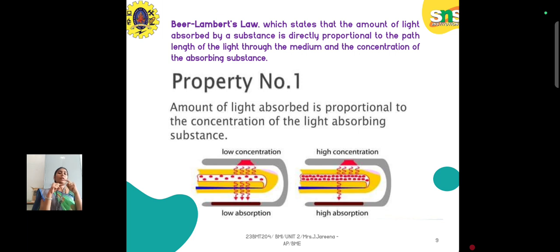When the light goes all the way to the photodetector, some absorption takes place based on the concentration of molecules present in the blood. We are focusing here on two molecules, oxyhemoglobin and deoxyhemoglobin. Based on the light wavelength, both will have different absorption values.